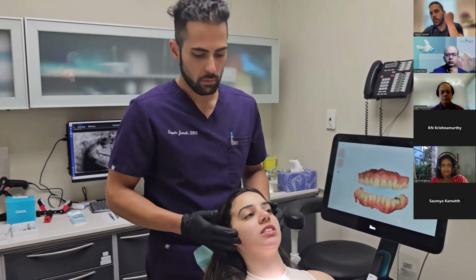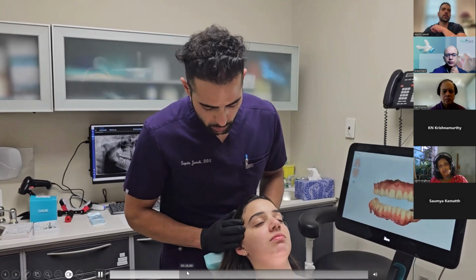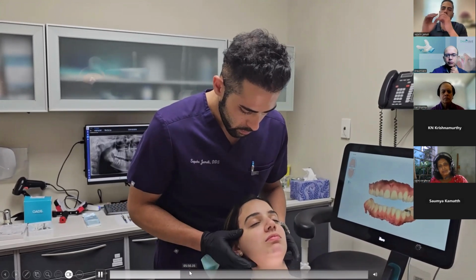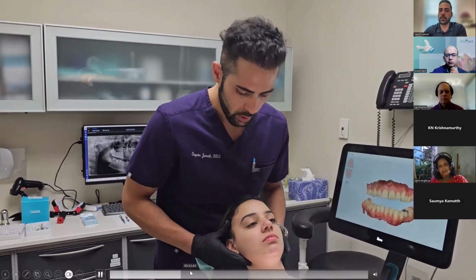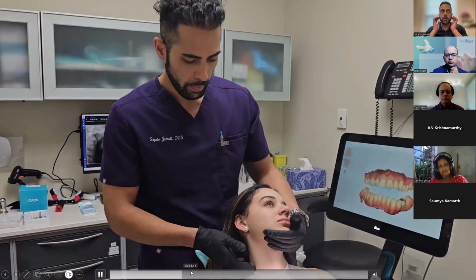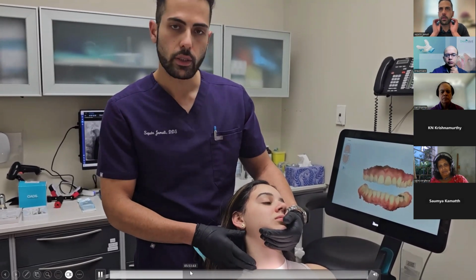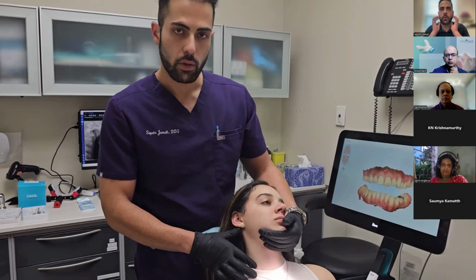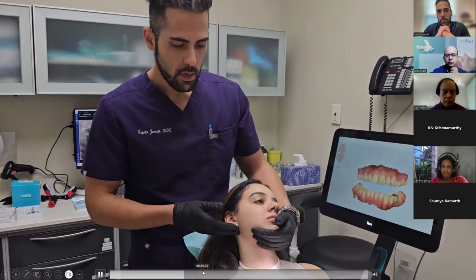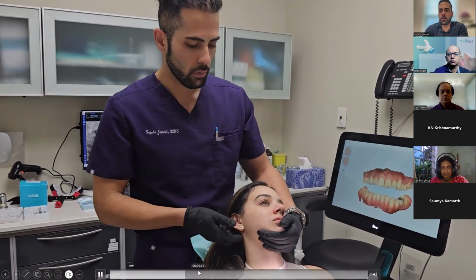It's not like when you've been to the gym or been running and you touch the muscle, it feels sore. So, no, it's not sore. That's good. Okay, that's your baseline. So if I'm doing this much pressure on the muscle of your face and you feel different, that's considered tenderness, that's considered soreness. And when you do that, suddenly the patient realizes that if I touch here and I feel pain, it's not because I'm touching the muscle of my face and my face is weak. No, that muscle has actually been tender, it has been sore the whole night. So that's an easy way to check the tenderness scale for the patients.